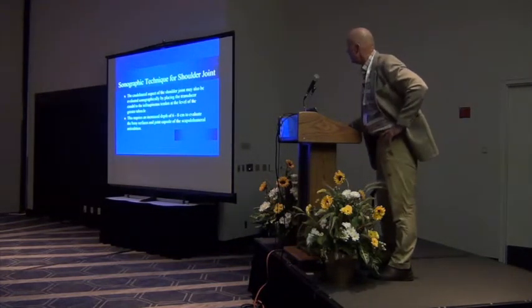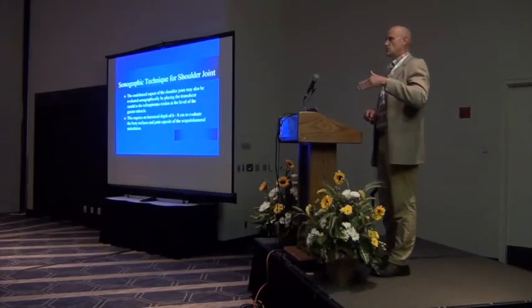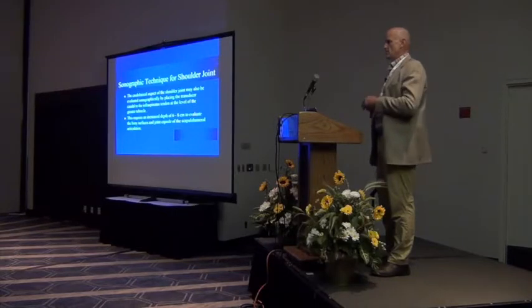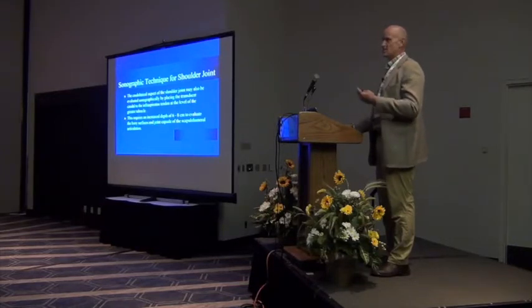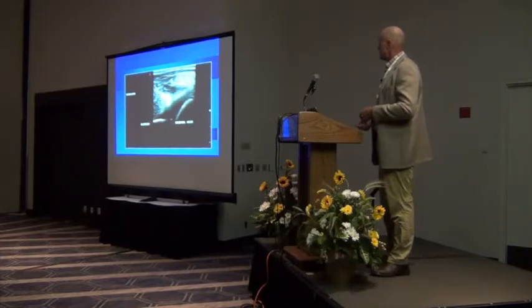Now the shoulder joint, again, most of the shoulders that I do, I like to look at them in longitudinal because it gives me a better impression of what's going on from the joint. And I have a mentality to look at things in a sagittal plane or a frontal plane before transverse, except when I'm looking at tendon and ligament. So that's typically what I'm going to do, I'm just going to stick the scan head in there. This is the glenoid, this is the humeral head.